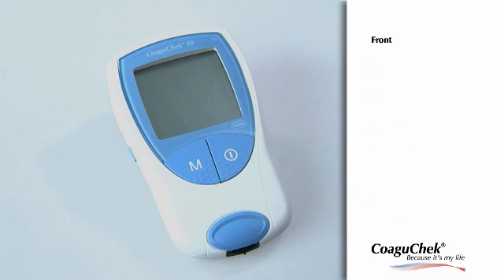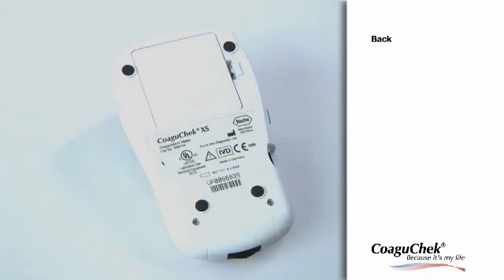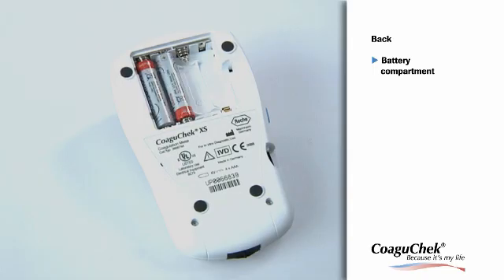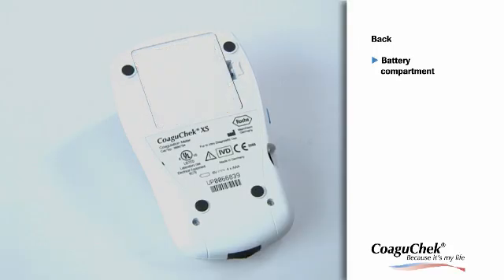Now we will look at the front of the meter. Press the on/off button to turn the meter on or off. Press the M button to view the previous results stored in memory and to change the meter settings. Press the Set button to enter or change the meter settings. At the back of the meter is the battery compartment cover. You can use four 1.5-volt AAA-type batteries. When inserting the batteries, please ensure the meter is turned off.